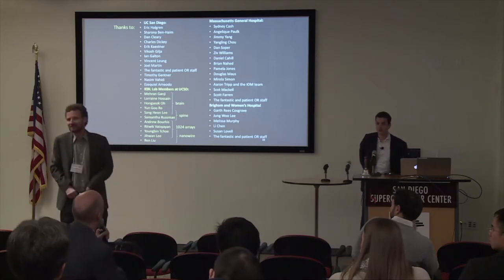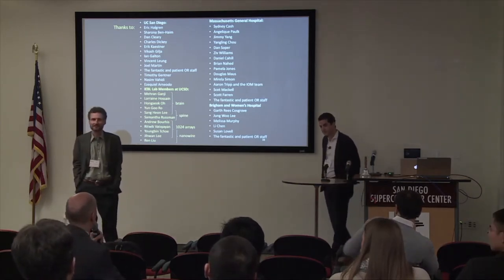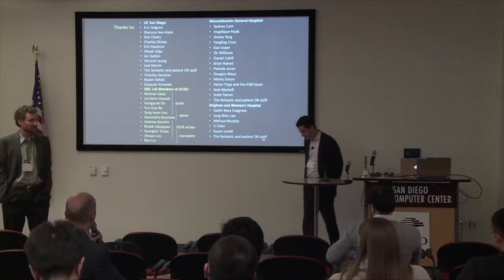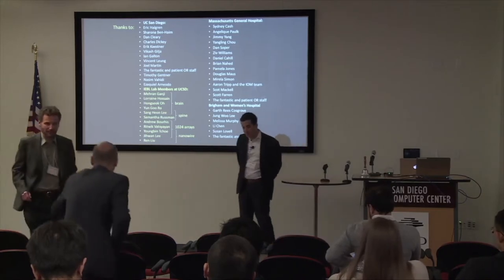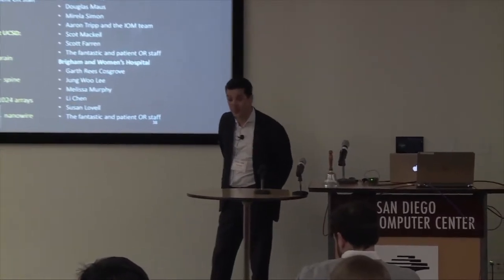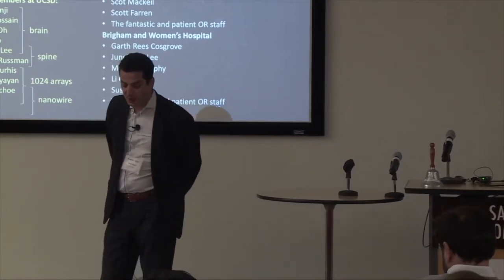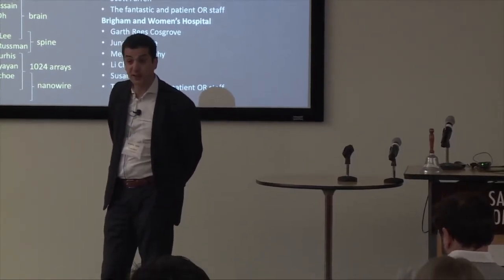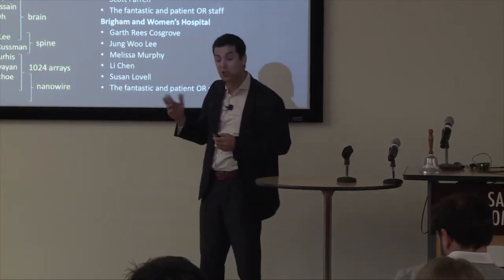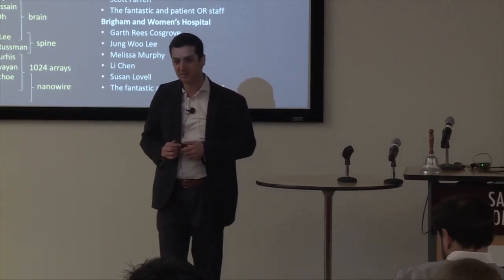There we go. So I was curious about the geometry, the width and the thickness of the traces on your 1K array, and what was the cable impedance over 10 centimeter length? Right, so the width of the lead is about 5 microns. Right now we're working with pitch of 10 microns. The resistance is about 3 to 10 kilo ohms, depending on how far in the contacts. Usually the contact impedance is about 20 kilo ohms for 30 microns. So we're just lower than the contact impedance itself.